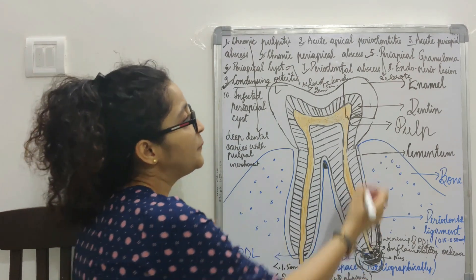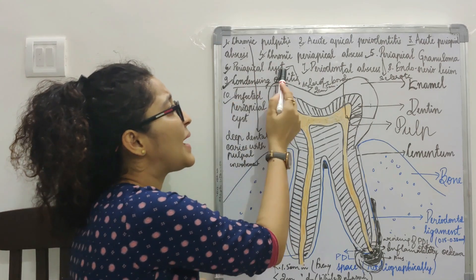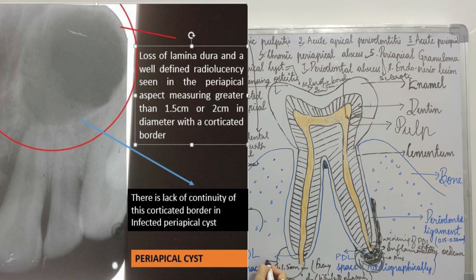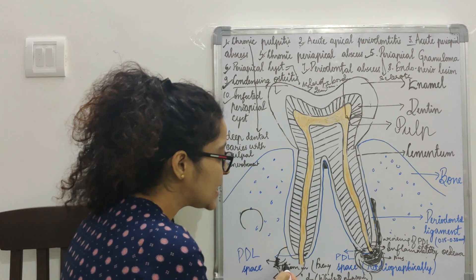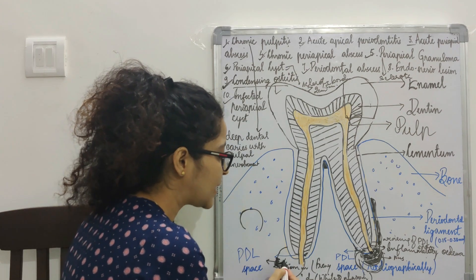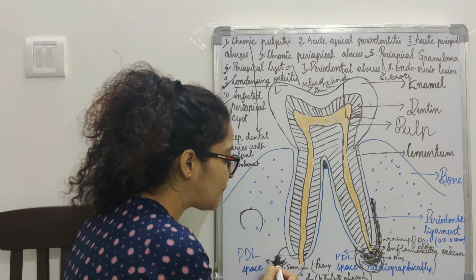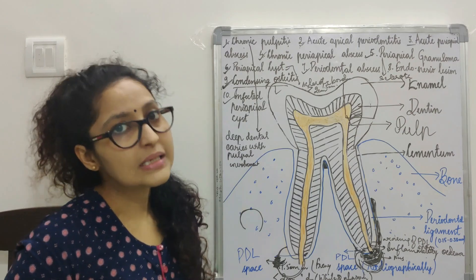Coming to infected periapical cyst — in a periapical cyst, you see a well-defined radiolucent lesion surrounded by a sclerotic border. In an infected periapical cyst, because it has now become acutely infected, there will be discontinuity of this sclerotic border, which is suggestive of infected periapical cyst.